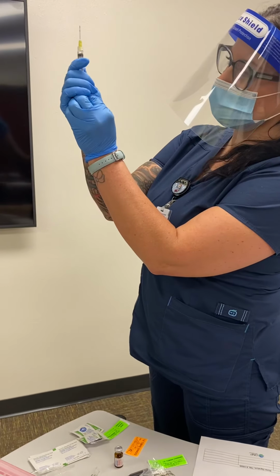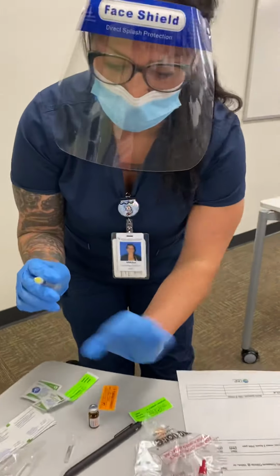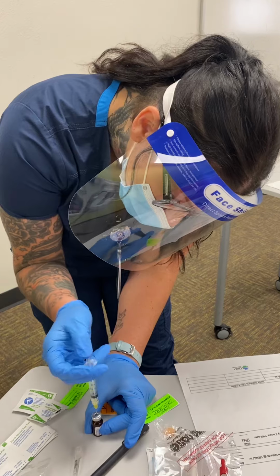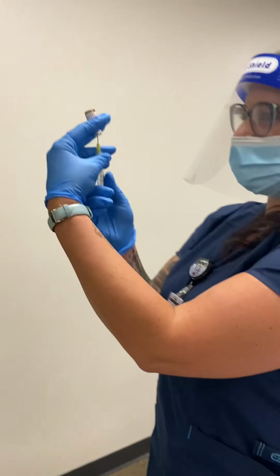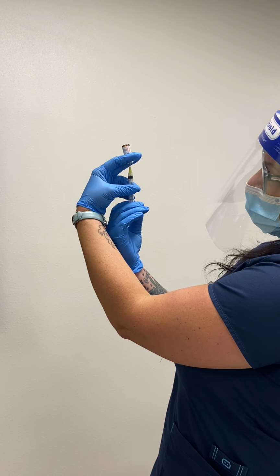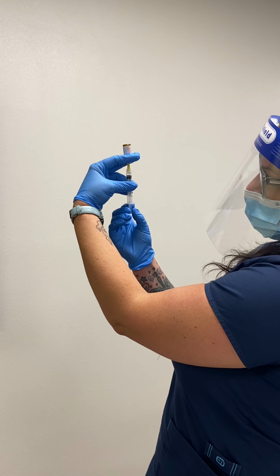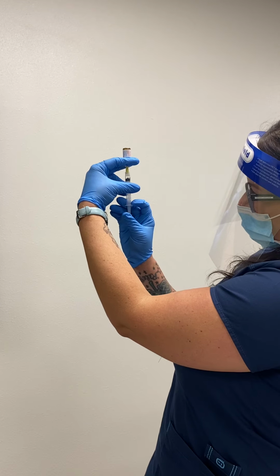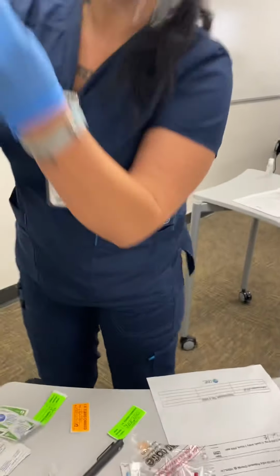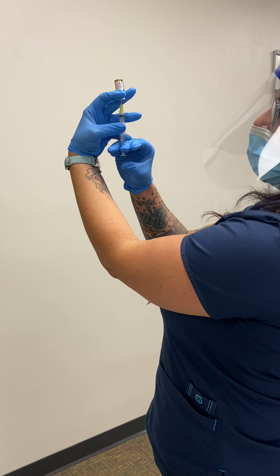And withdraw 0.4 of air. Check that. Before I inject it, I would clean it again, but for video purposes, it's clean, it's dry. Inject that into the airspace. Invert. Big old air bubble on that one. Hold on. All right, so just make sure your bubble is not in the air when you're pulling your meds out.